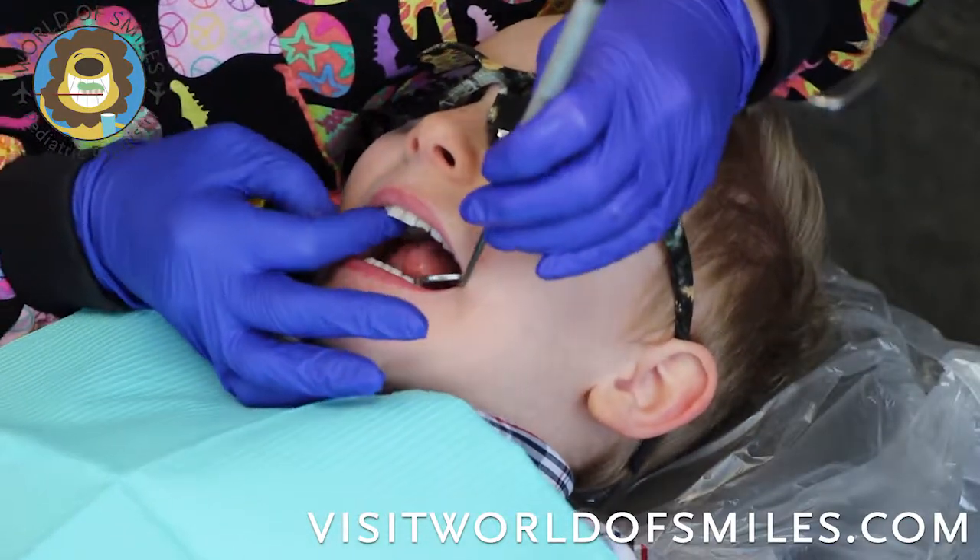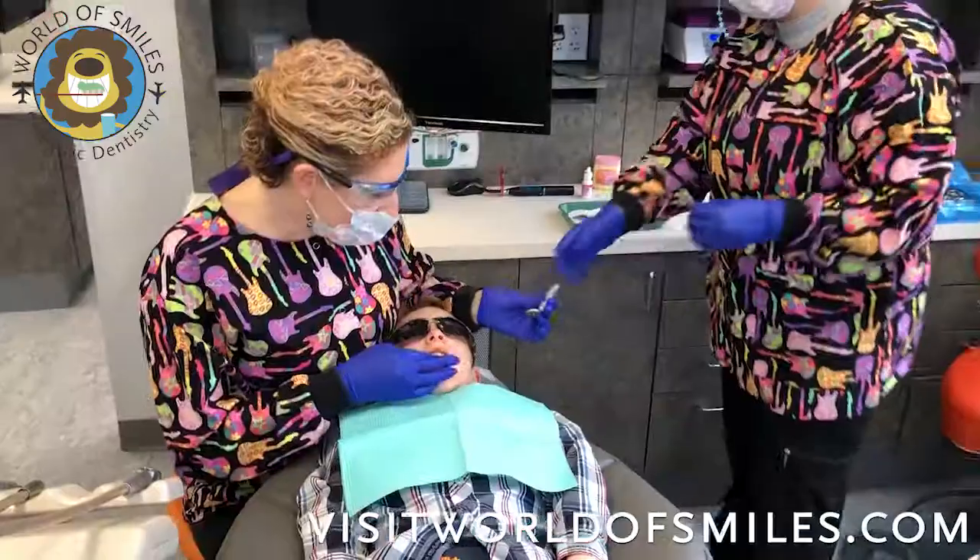And I see cavities in the upper left teeth. Let's get them.